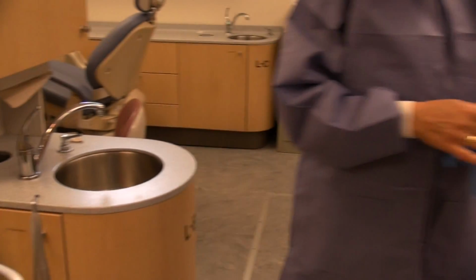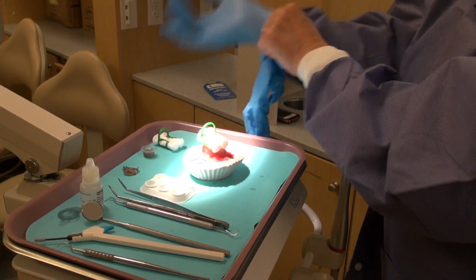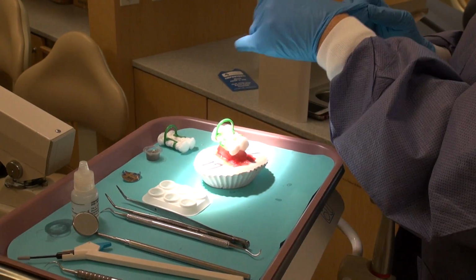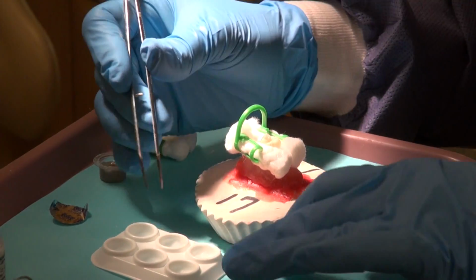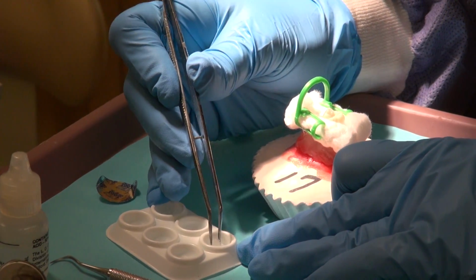Once you have this acid etch on your gloves, you're not going to be able to see what you're getting the acid etch on when you touch anything. And if you happen to touch the patient's soft tissue, you will create a phosphoric acid burn. So you want to make sure that your gloves are nice and dry without any phosphoric acid.